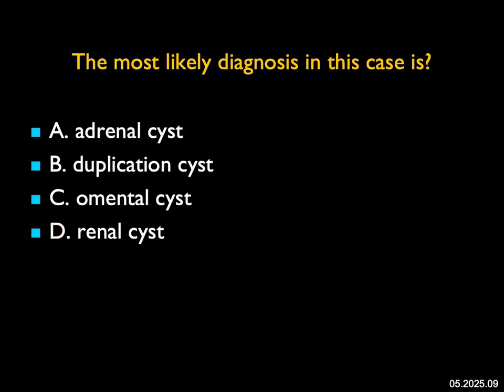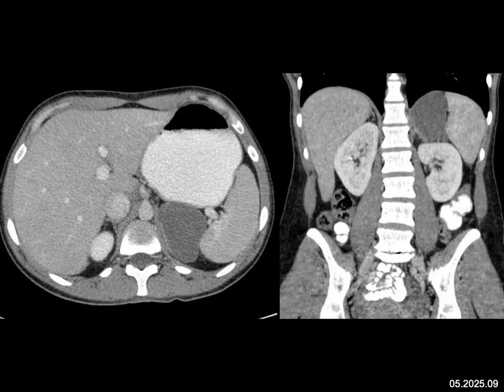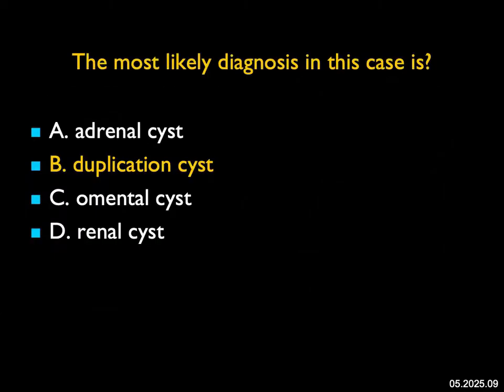The most likely diagnosis in this case: on the axial and coronal views, you see a cystic lesion abutting the adrenal gland, abutting the spleen, and above the kidney. You could think about an adrenal cyst, but I can see the adrenal pretty well, making it unlikely. An omental cyst is not a great location, though mesenteric and omental cysts can occur. You could think about a renal cyst, but the way this pushes down on the kidney suggests it is not coming off the kidney — it simply abuts the kidney. The best diagnosis is a duplication cyst. Duplication cysts abut the diaphragm commonly, and they're benign lesions that can be confused with other pathologies.